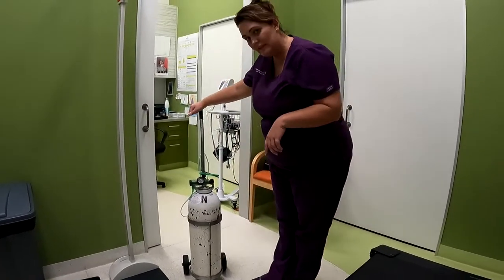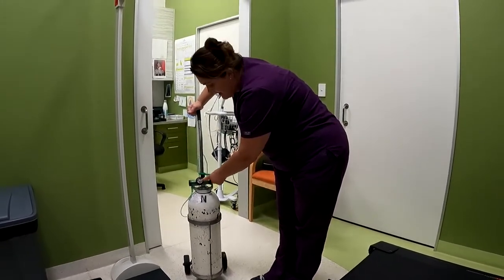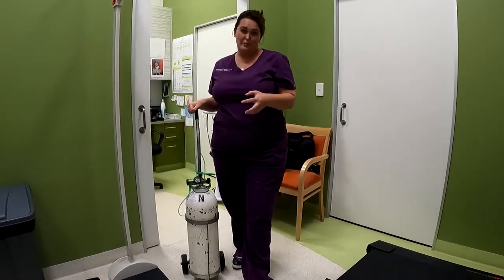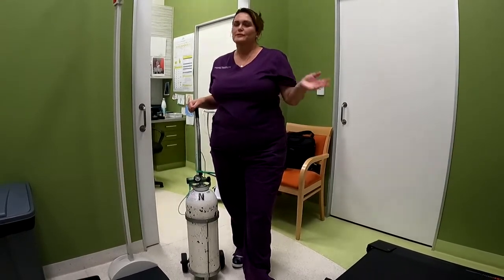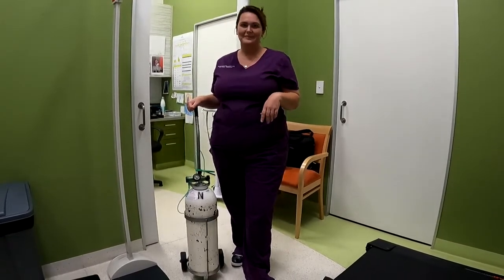The oxygen delivery people will show you on your dial when to call them to order new oxygen. Just do bear in mind that they don't deliver on a weekend except in an emergency. So if, say, on a Thursday you think you're going to run low, it's always better just to ring and order and they'll deliver the next day.